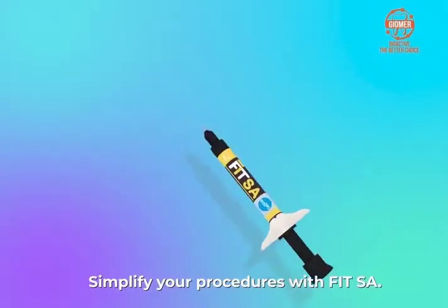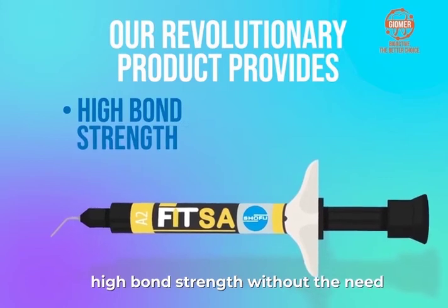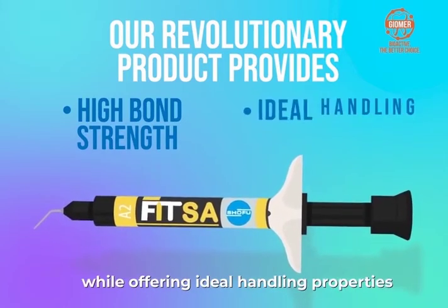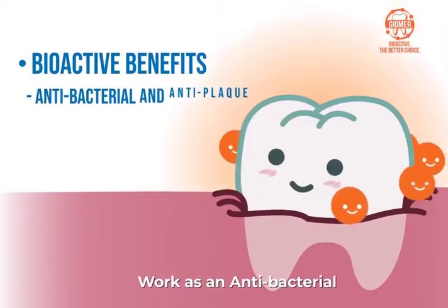Simplify your procedures with FitSA. Our revolutionary product provides high bond strength without the need for the technique-sensitive bonding procedure, while offering ideal handling properties and bioactive benefits that work as an antibacterial and anti-plaque.